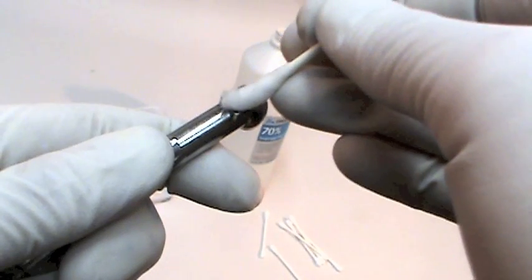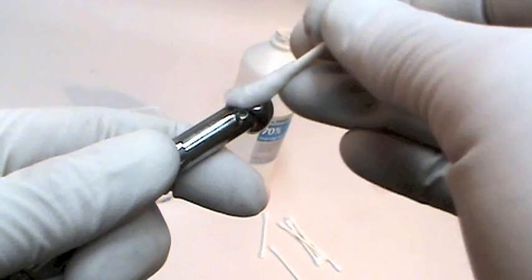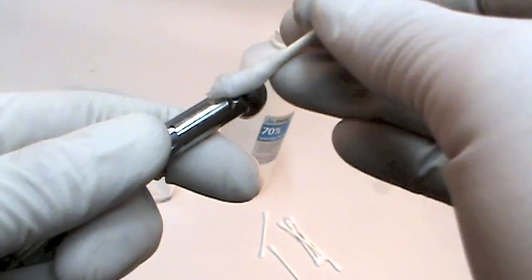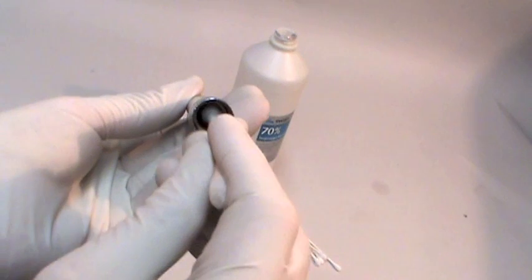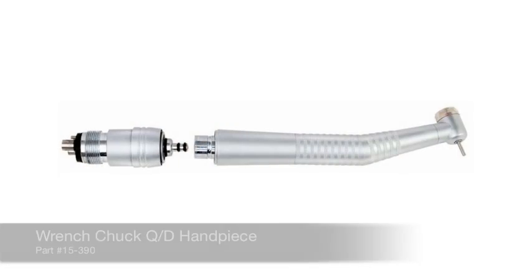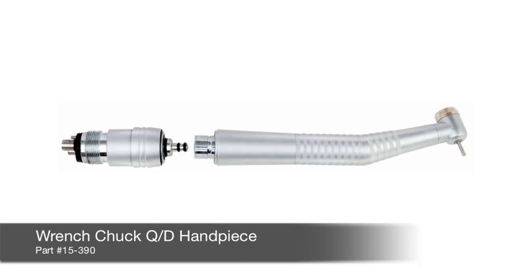Handpiece fiber optic surfaces can be cleaned using isopropyl alcohol or acetone on a cotton applicator. Don't pick the fiber optic ends with any type of sharp instrument. The quick disconnect connections and handpiece exterior can also be wiped down with isopropyl alcohol.